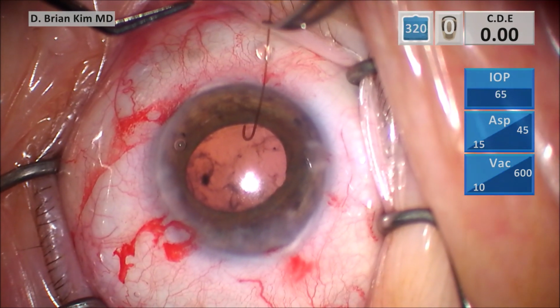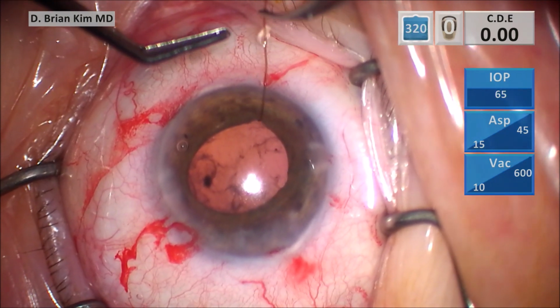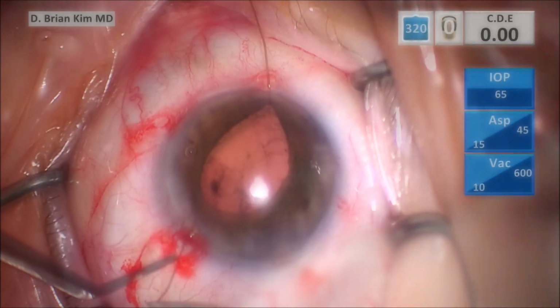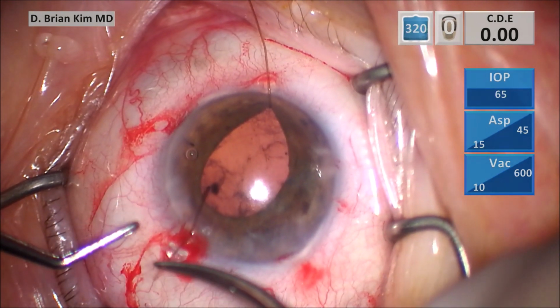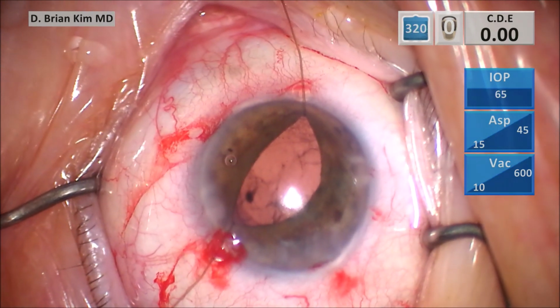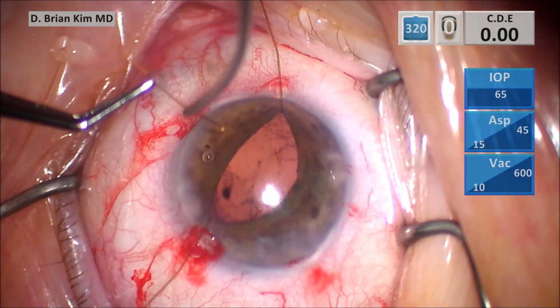And when you do a lot of these techniques, the iris hooks really are not that tedious to put in and out. And these are a single-use type of hook. They're rather delicate, so you can't really be too rough with them. But because they are single-use, once I'm done with them, I can just pull them out very easily. I don't have to worry about trying to preserve the hook, and so it'll be rather quick to take them out at the end.